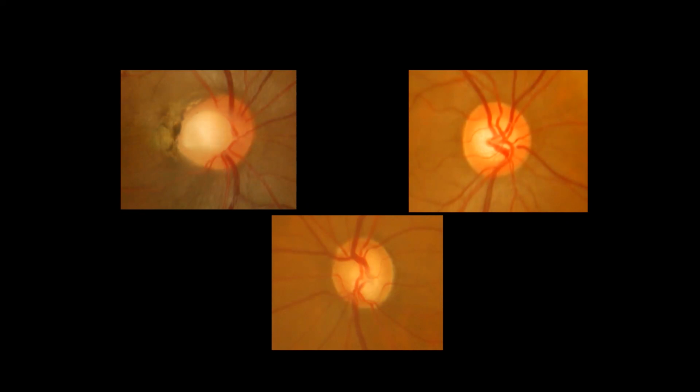Good. The inferior part? The inferior part, I can see cupping, mainly focal cupping with inferior notching. Okay, so why would you say it's focal? Because when you compare to the superior and inferior poles, you are having more thinning inferiorly than the superior part. Yes.